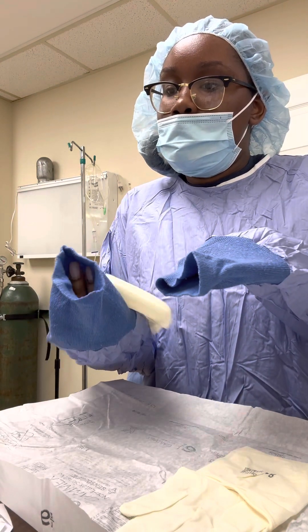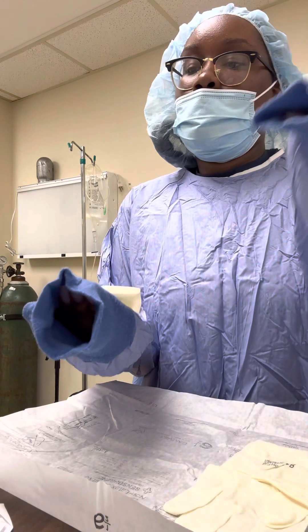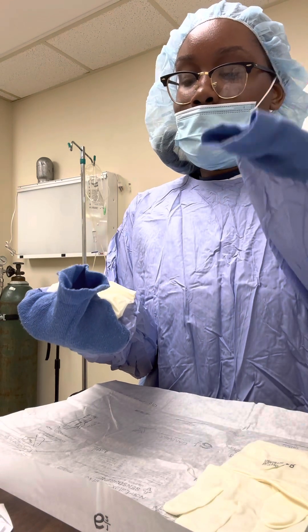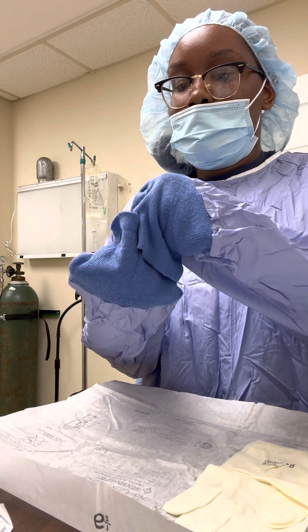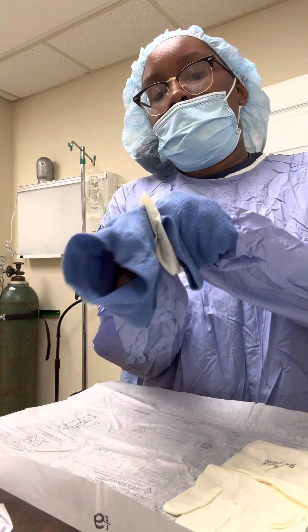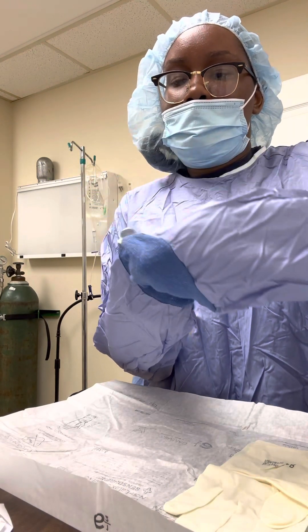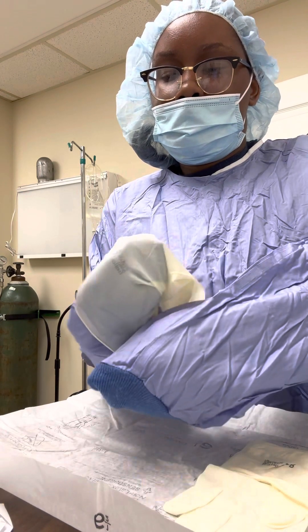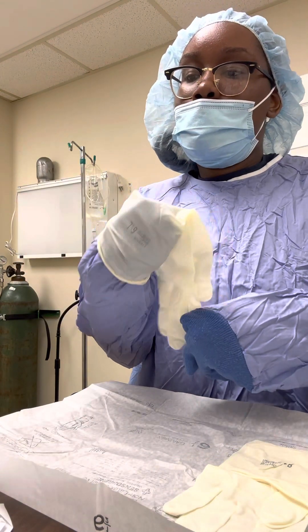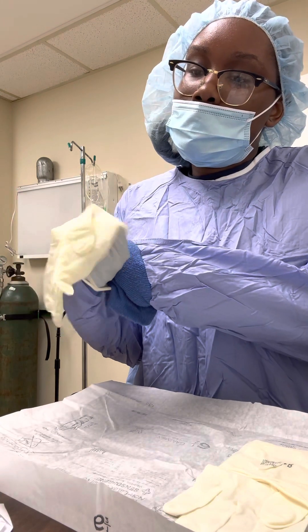It says to cuff the ends. I'm going to grab the opposite side of the glove cuff with my other hand and pull the glove over my hand. My hand isn't actually in the glove yet — it's just there. So now I'm going to press the gown and the glove together and pull the glove completely onto my hand. Got to get that pinky in there.